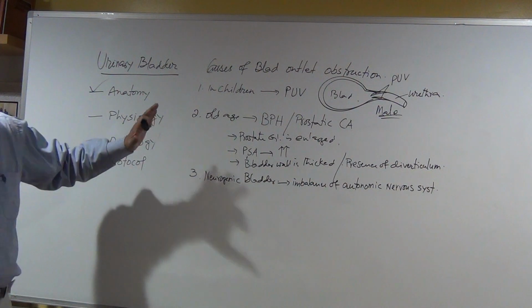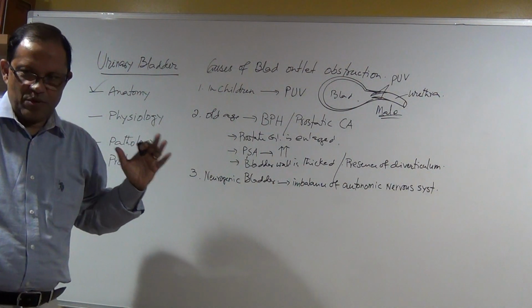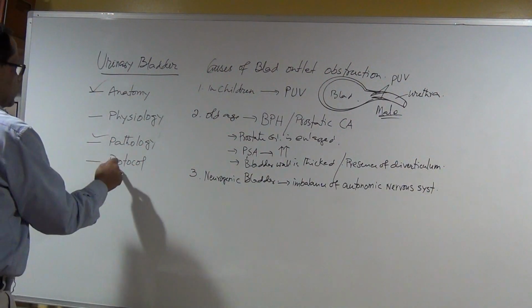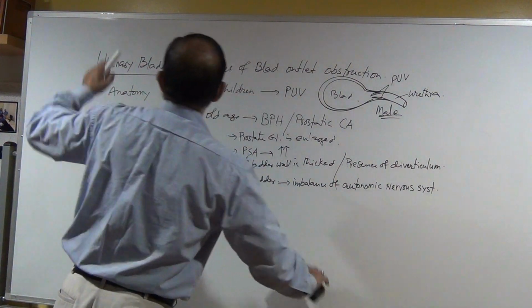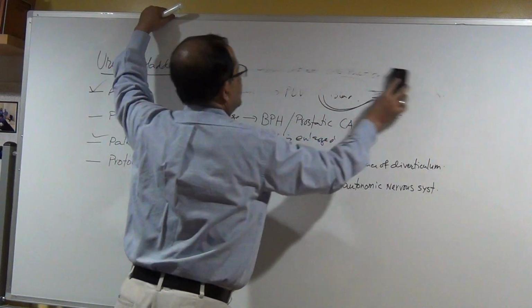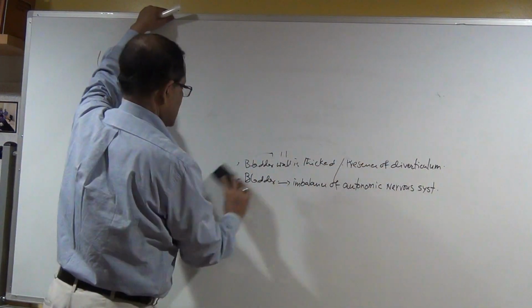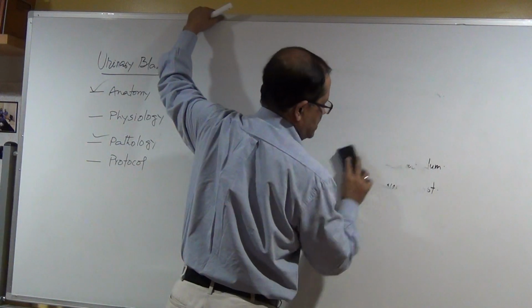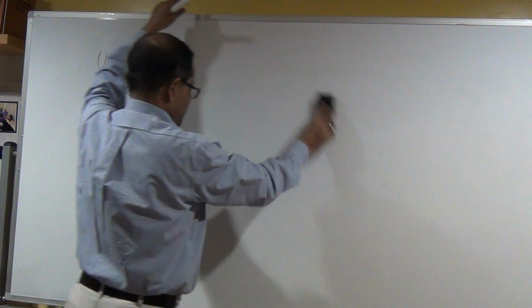Okay, you got in short a thorough knowledge about the bladder, right? This is a very good lecture. Now, protocol. What is the name of the protocol to evaluate the bladder? We need to evaluate pre-void and post-void residual volume.